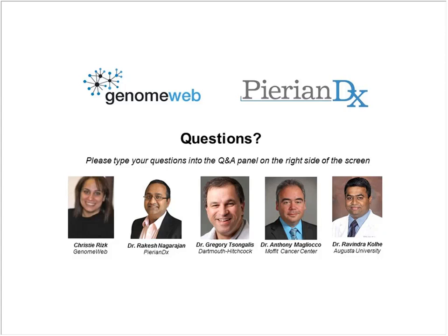And Rakesh, would you like to add anything? Yeah, I think this is the chicken or the egg thing, and this has been an academic debate for about 6 years now, with greater and greater adoption. That's a groundswell from both patients and physicians, as well as organizations such as those on the call who are believing in the scientific and medical merits of more comprehensive profiling. I think there have been a few papers now that have been published talking about clinical utility of a more comprehensive assay than very targeted, FDA-approved companion diagnostics.